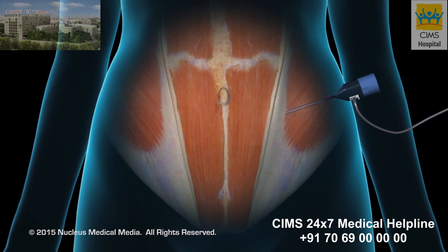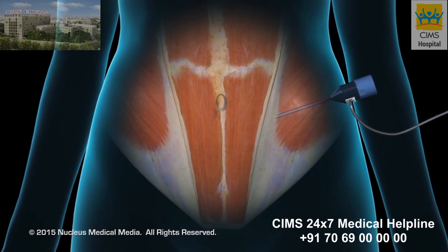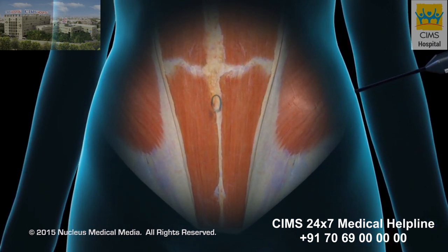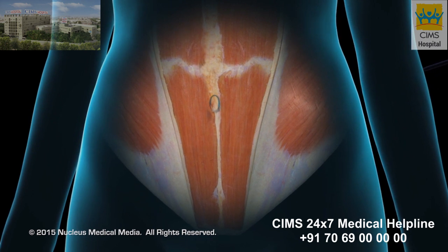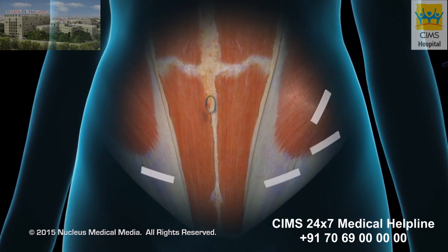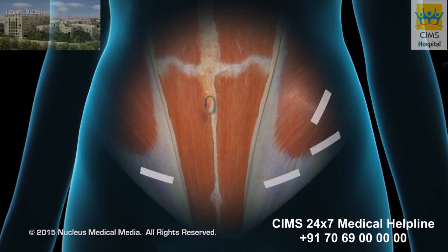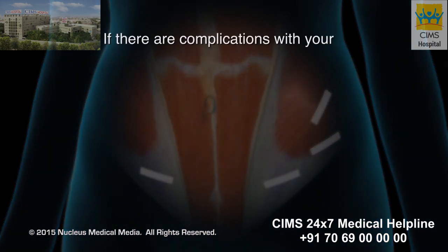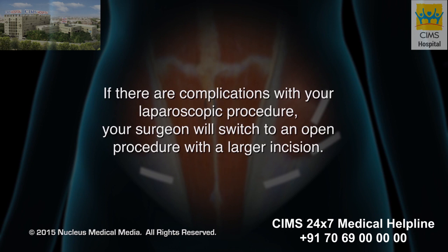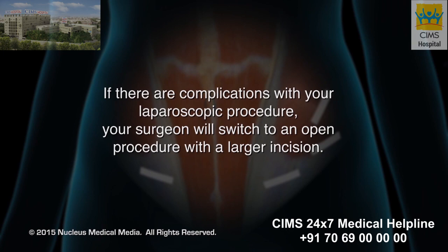At the end of the procedure, your surgeon will remove the instruments. The incisions will be closed with sutures or skin glue and covered with skin closure tape. If there are complications with your laparoscopic procedure, your surgeon will switch to an open procedure with a larger incision.